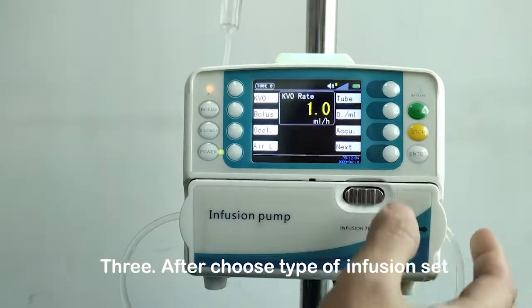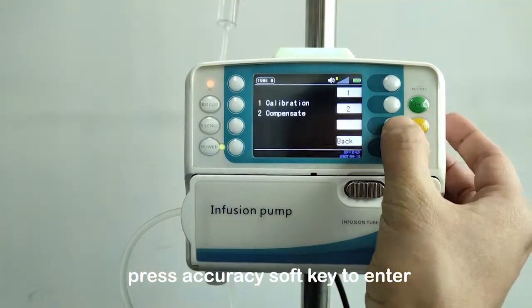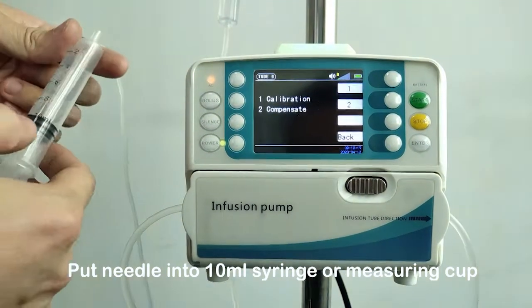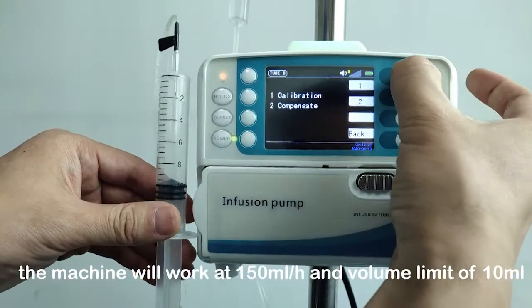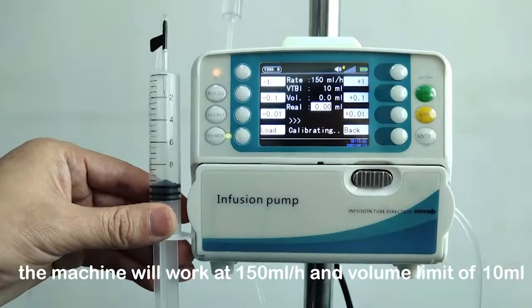After choosing the type of infusion set, press the accuracy soft key to enter the accuracy calibration interface. Put the needle into a 10 milliliter syringe or measuring cup. Press the start key. The machine will work at 150 milliliters per hour with a volume limit of 10 milliliters.